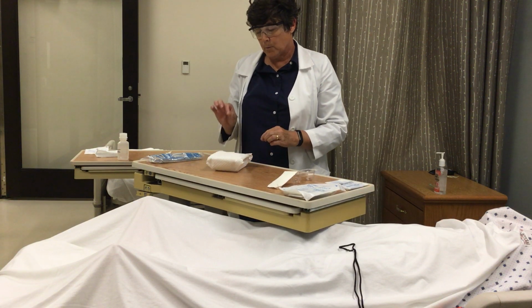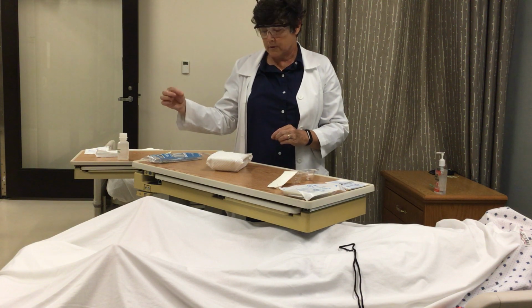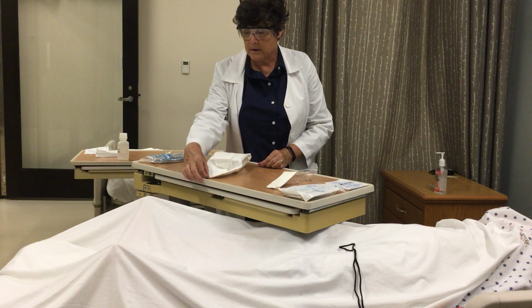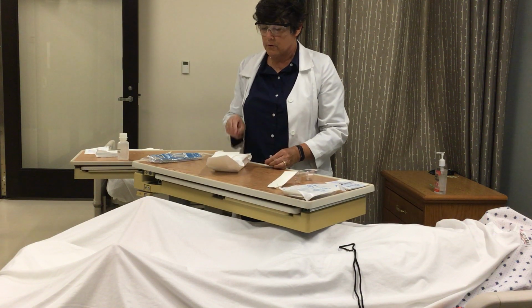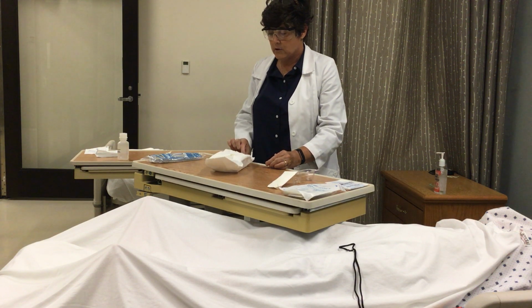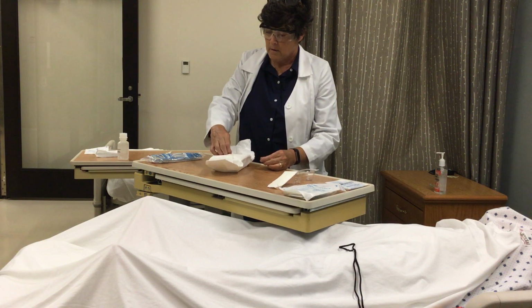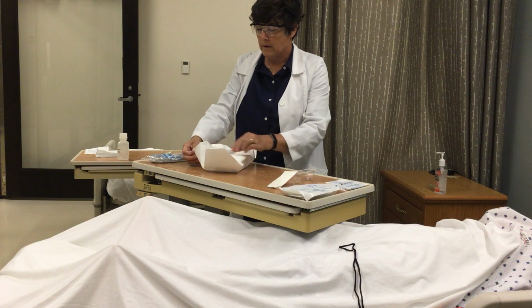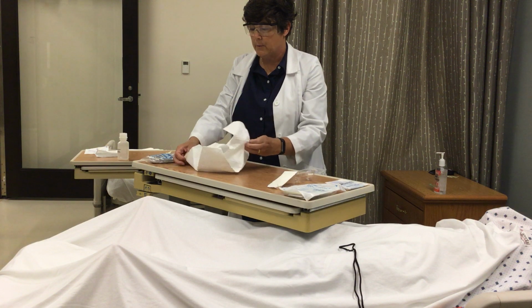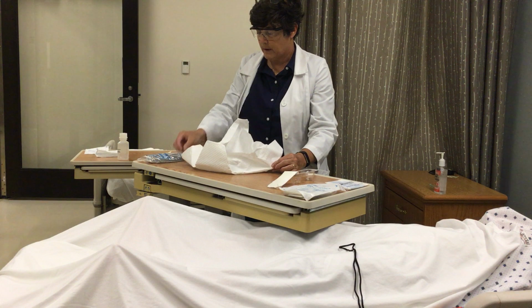Okay, now this particular prepackaged kit doesn't open in the traditional manner. It has a first flap that you open away, but then it has a next flap that opens towards you. So just follow that direction. And then you'll have to open the next flap, which in this case happens to be your right flap, and then the left flap. And with all new kits, the paper's pretty stiff, so you just have to be careful how it all pops open.